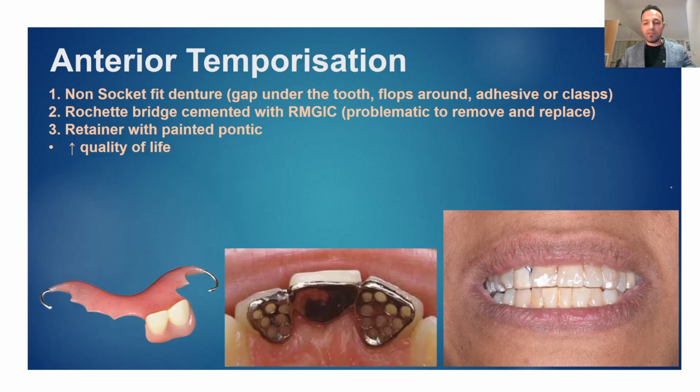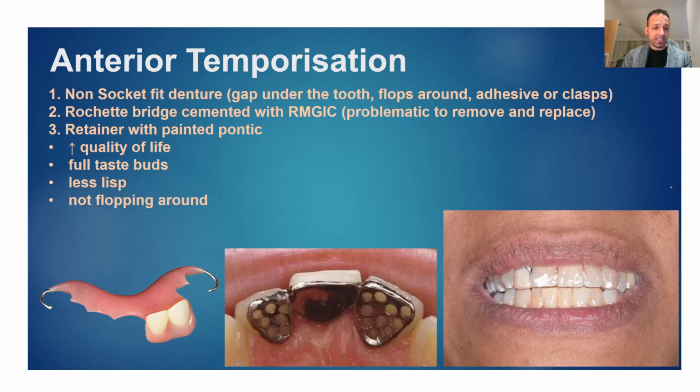Well, first of all, it's increased quality of life. There's no coverage of the palate, so taste and speech can be better tolerated. You've got full control of your taste buds. All that roof of the mouth isn't covered. Of course, that's the same for the bridge. And you've got less of a lisp because you don't have any plastic. There's no flopping around of the device. It clicks into place, and this is the main benefit.